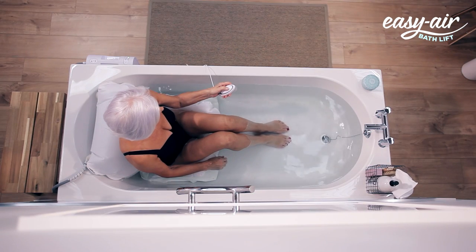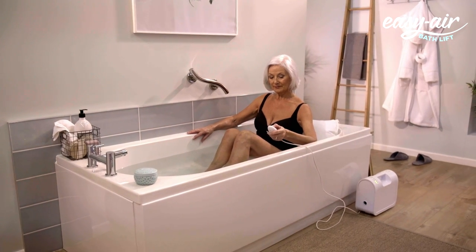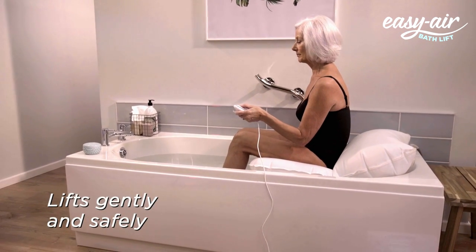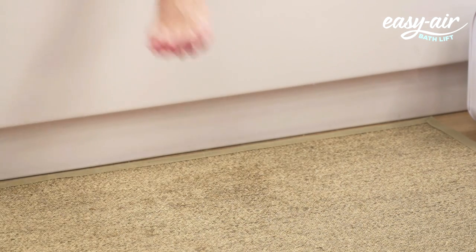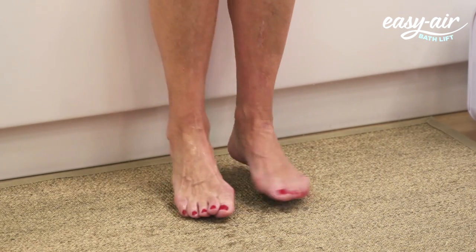When you're ready, sit up and position yourself at the back of the seat. Using the waterproof handset, re-inflate the Easy Air Bath Lift to raise yourself out of the bath. The Easy Air Bath Lift moves gently and safely, making getting out of the bath almost as relaxing as having one. Once fully inflated, rotate your body and swing one leg at a time out of the bath.